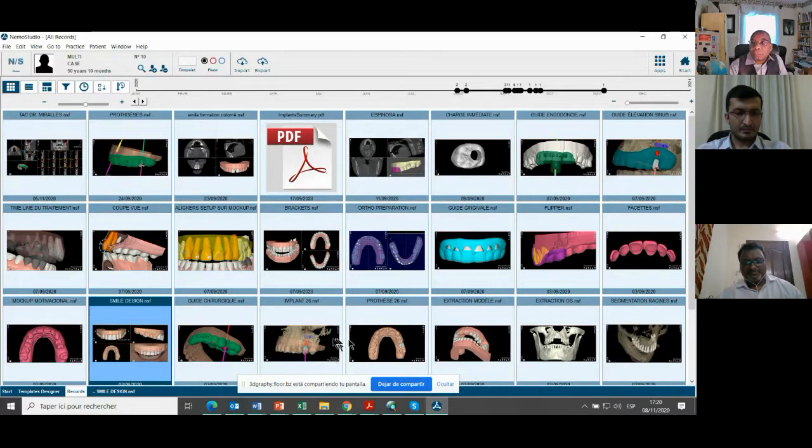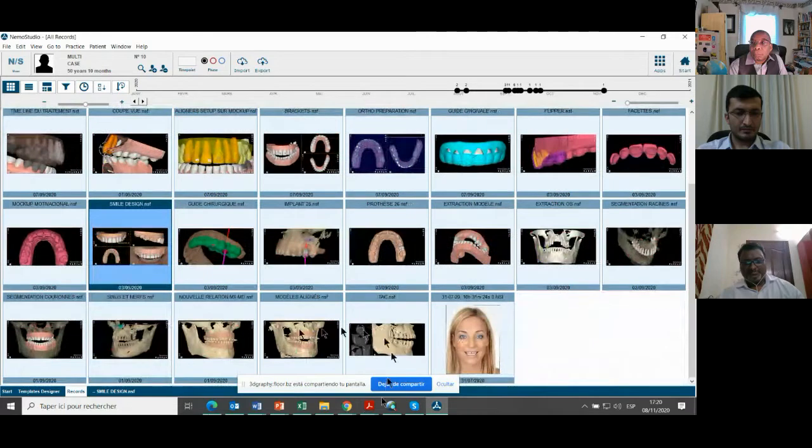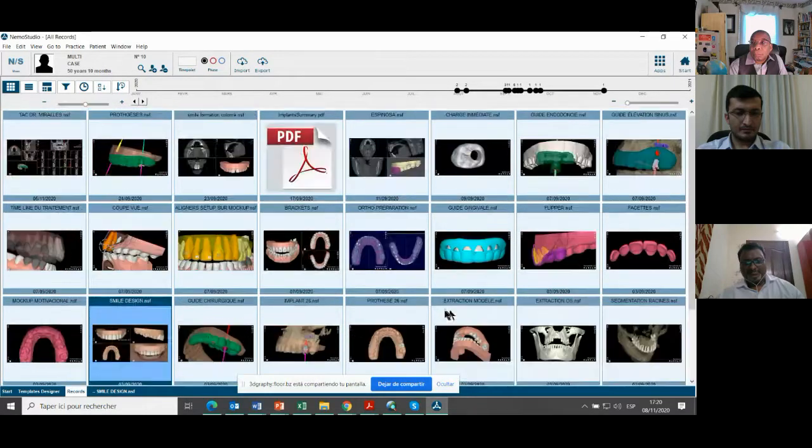And then, because I wanted, and this I will show to you, I changed to the orthodontic model, and with the same files that I got from the very beginning, and because I did the segmentation, I was able to do an orthodontic setup.